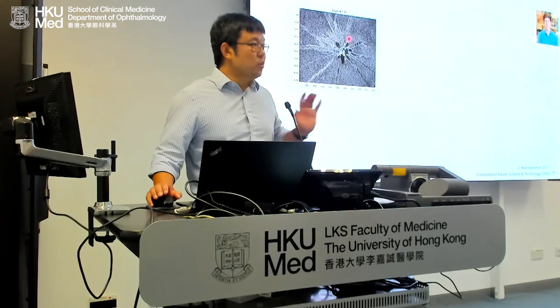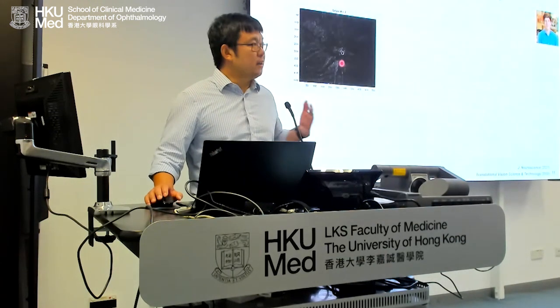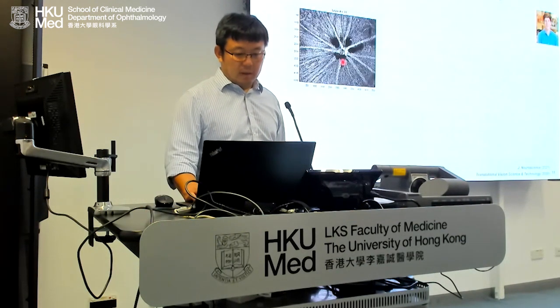This is the fibergram. So we call that fibergram. In mouse and in tissues, we can resolve individual fibers. What you see here is a 2D movie of consecutively acquired OCT volumes. And then from here, we can quantify the fibers and vessels altogether by doing texture analysis. But this is a lot more straightforward because fibers are sparse in rodent eyes.